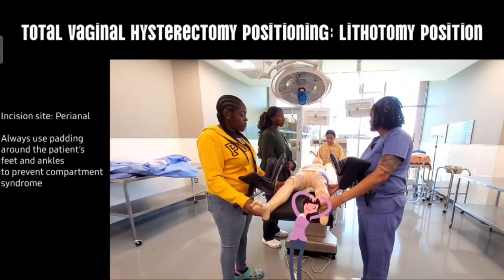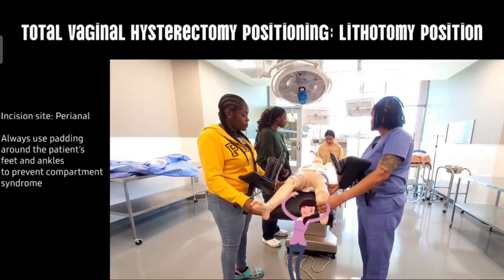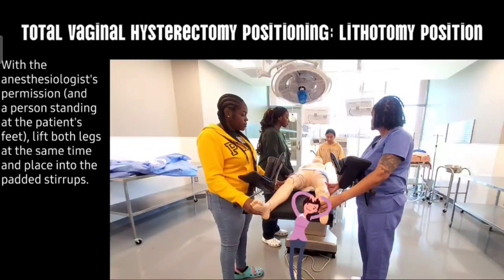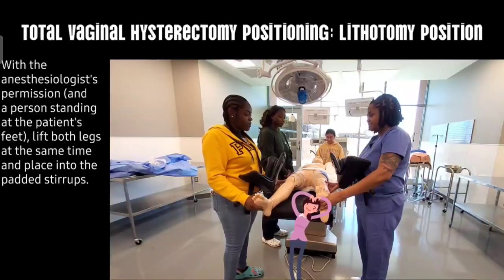Bring the patient's operative side to the edge of the mattress, which we've done. Then attach the sockets and stirrups to both sides of the table and adjust the height and length as equally as possible, which we've also demonstrated over here. Each position can be adjusted based on the patient's specific needs.